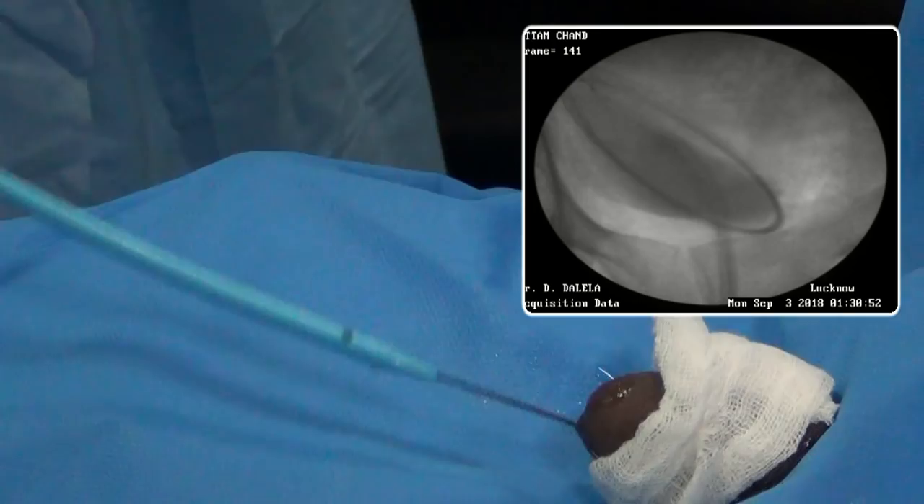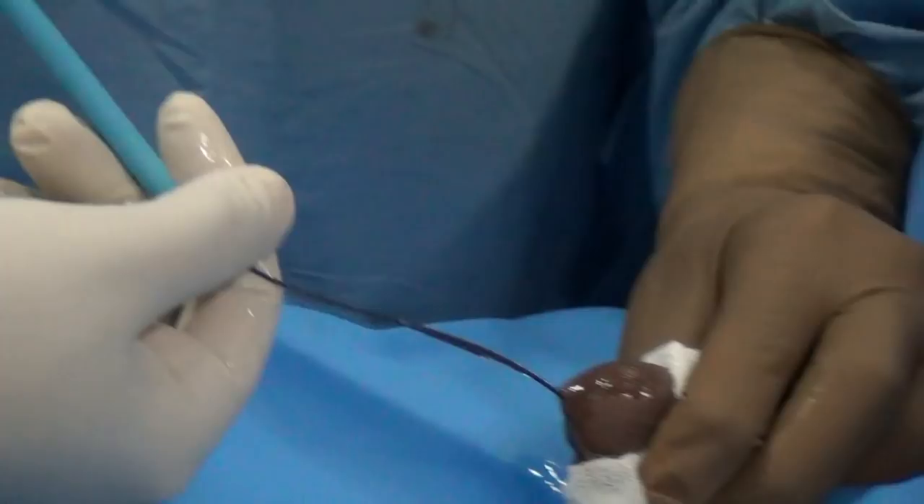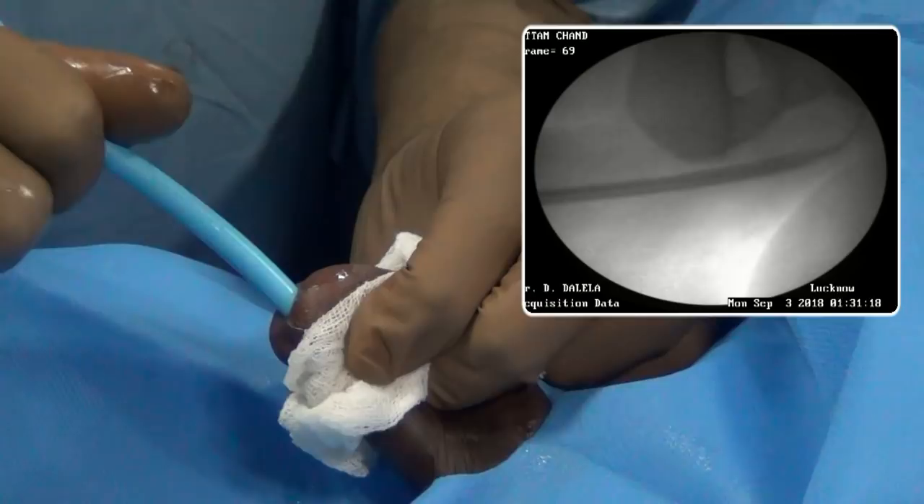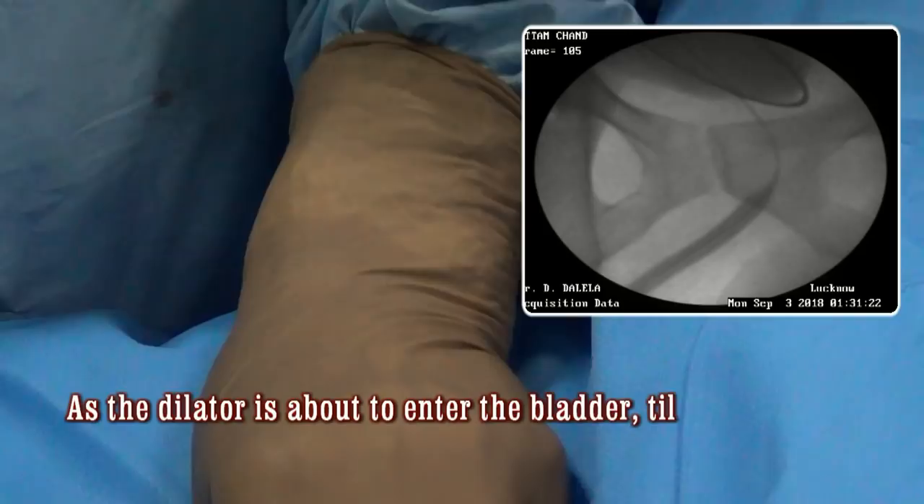Now you are passing thicker and thicker dilators — this time it is a 16 French dilator over the guide wire. As you pass these thicker dilators through the prostatic urethra, you have to bend the dilator toward the OT table, meaning you ventriflex the penis between the thighs so as to tilt the dilator and allow it to negotiate easily through the bladder neck into the bladder.